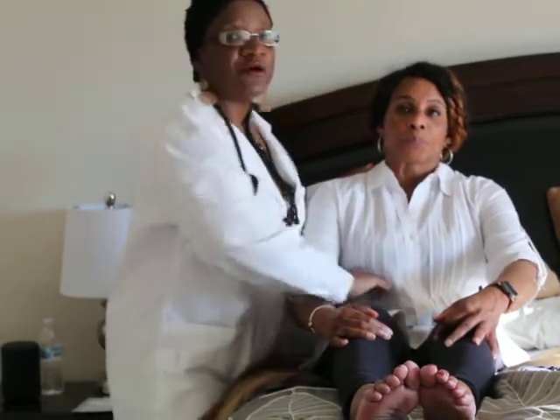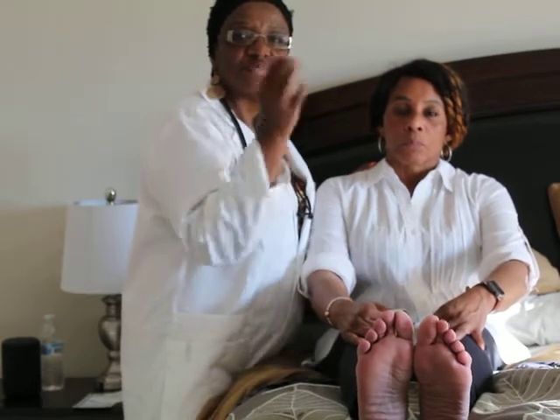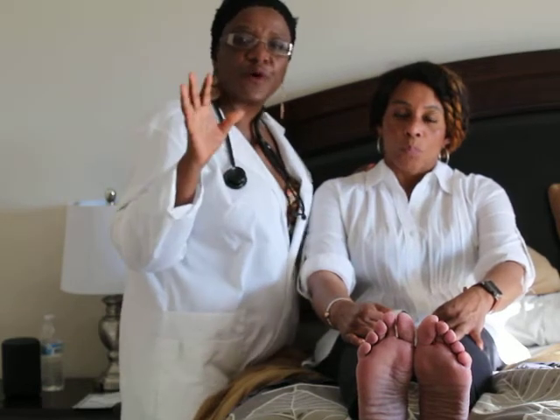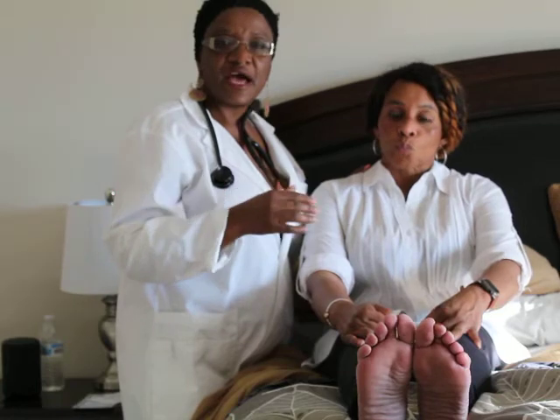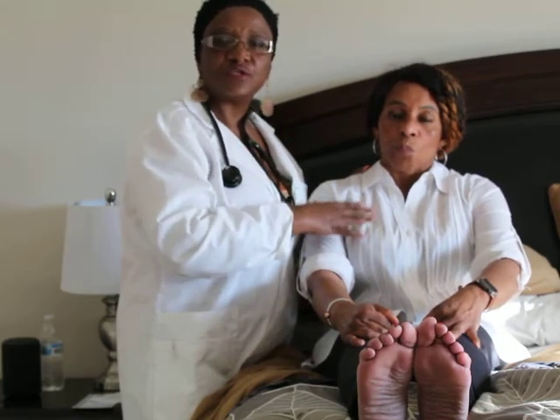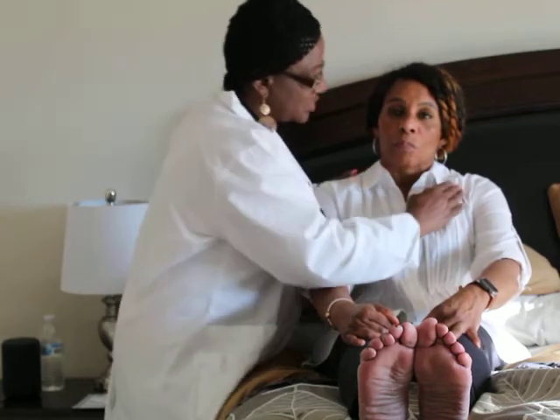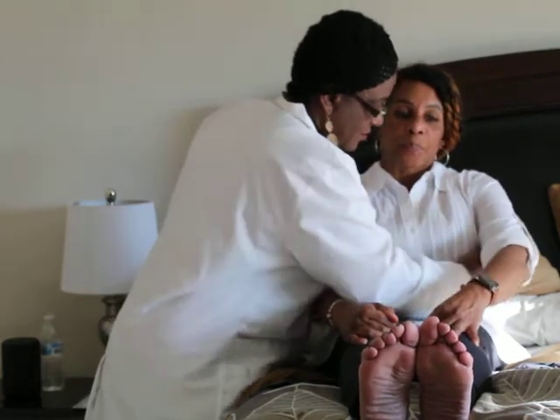And under normal circumstances, I will have to undress this patient. This is supposed to be on the bare skin of the patient. But because we are filming, and if it's in a clinical setting, I will have to undress her and do this on her bare skin. So just say 99.